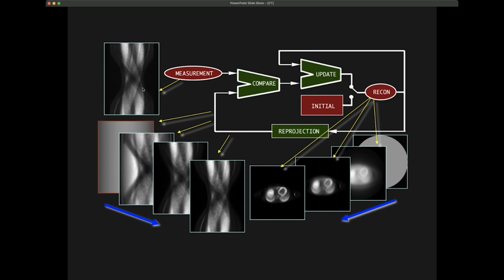But you can already imagine, the scanner will look like we have inside this X-ray tube, we have a detector which has to rotate. Since we need to make this engineering-wise, there will always be some kind of errors in it, because no machine is perfect. So that means that what we actually can do is in this virtual scanner, we can also put the problems of the scanner. We can make this a much more realistic scanner than the ideal scanner that, of course, the Fourier reconstruction requires.